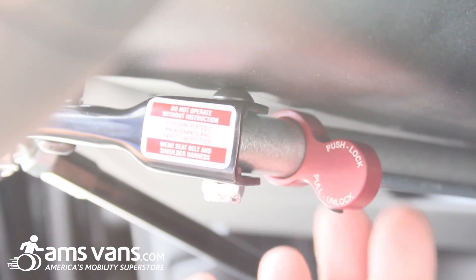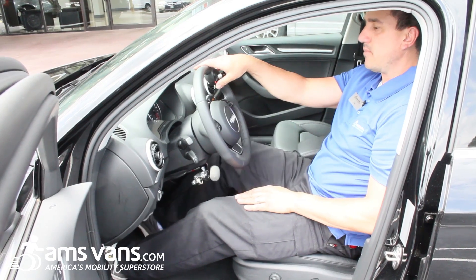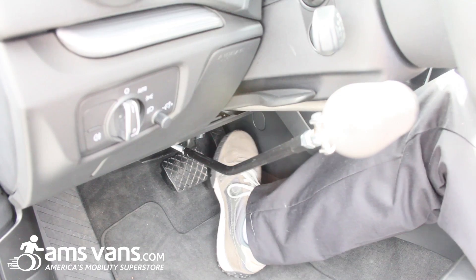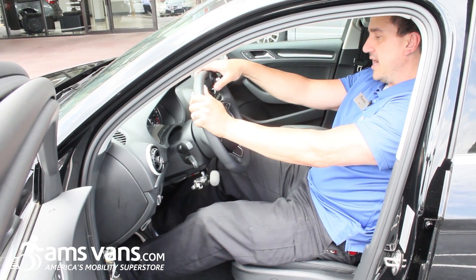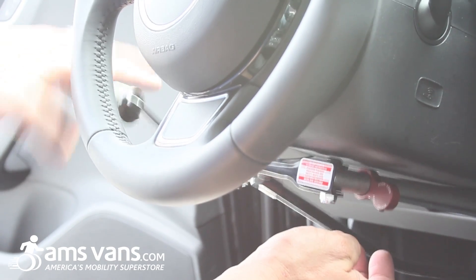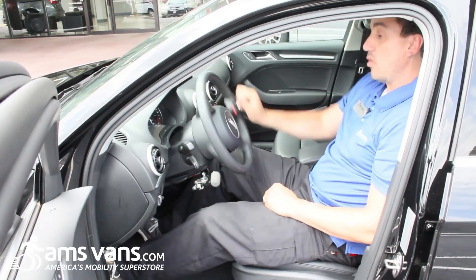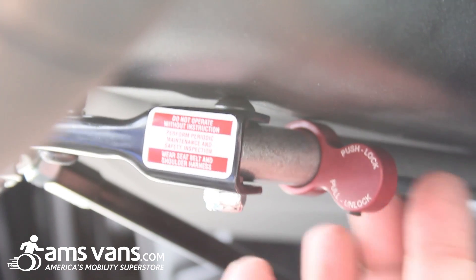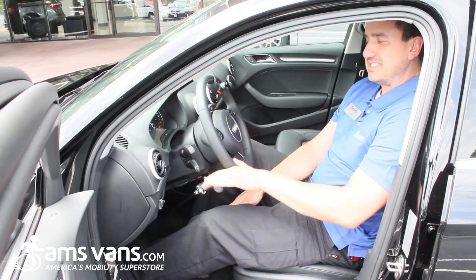You do have an auto lock feature right here which you push, locks the gas so your able-bodied driver can still use their feet normally. When an able-bodied driver drives, the only thing that's going to move is the brake handle, but it will be locked so somebody turning is not accidentally hitting the gas when they don't want to. And then once the person who's going to drive with the hand control is ready, they pull the auto lock feature back and it releases the gas.